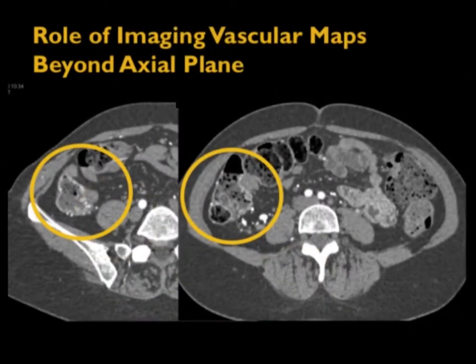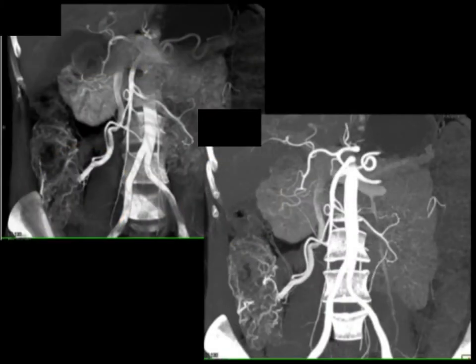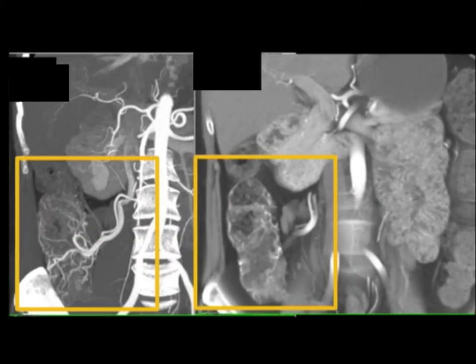Or this example: when you look quickly, the cecum doesn't look that impressive in this patient with GI bleeding, even if I circled it. But if I go from circling it to 3D reconstructions, now look at the vascularity — that cluster of vessels for about 15 centimeters and the prominence of the patient's ileal SMA branches. Very, very impressive abnormal vascularity. Look at how abnormal the vessels are in the right colon. That's a very good example of angiodysplasia, a common cause of GI bleeding, very nicely seen on 3D imaging and very easy to walk by on axial imaging.